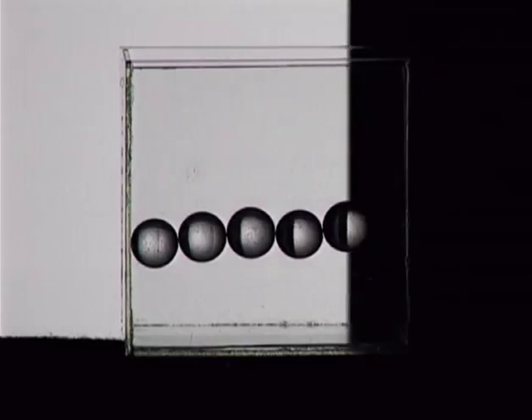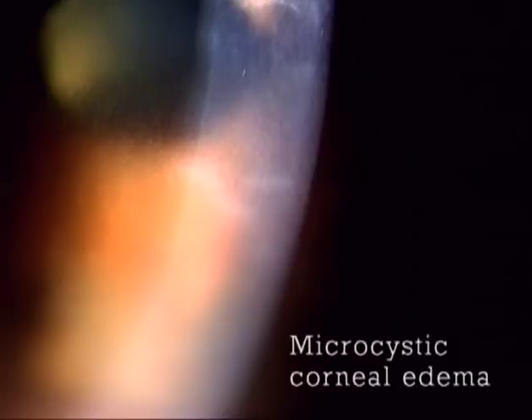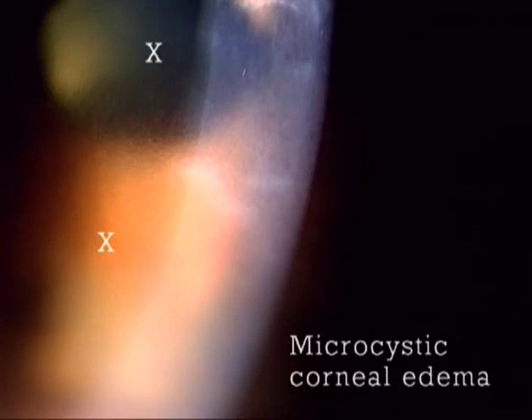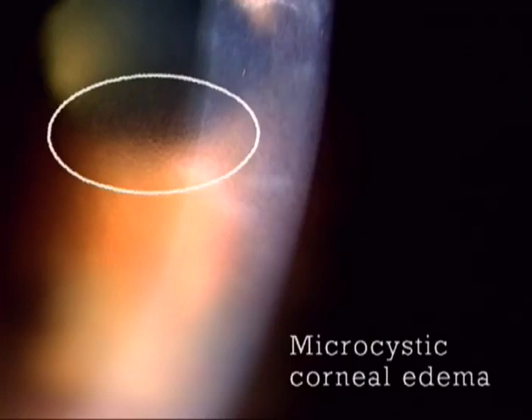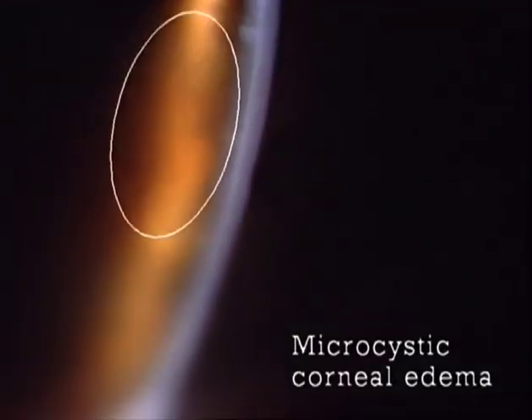The observation can be greatly improved by using the method of backgrounds with contrasting borders explained above. Such contrasting borders can be found at anatomical margins, such as the pupillary margin in this example of corneal edema. While microcysts of the epithelial edema are hardly visible elsewhere, they are easily recognized here. Furthermore, by narrowing and shifting the beam, contrasting borders can be generated artificially by the examiner. Now the microcysts of corneal edema become visible against the margins of the light beam on the iris.